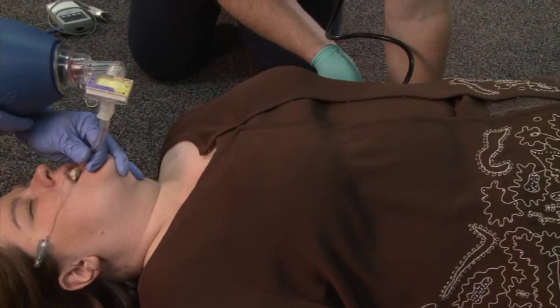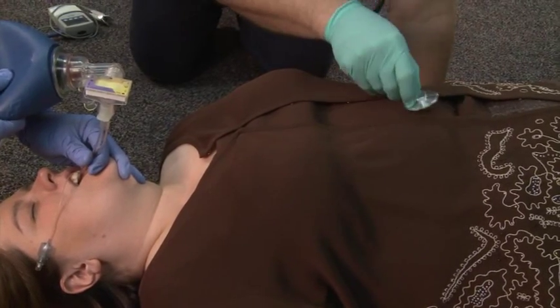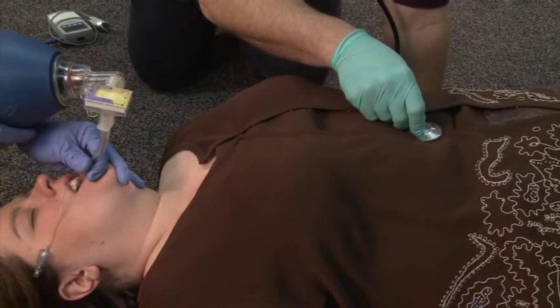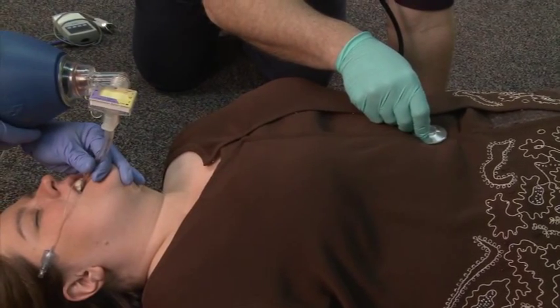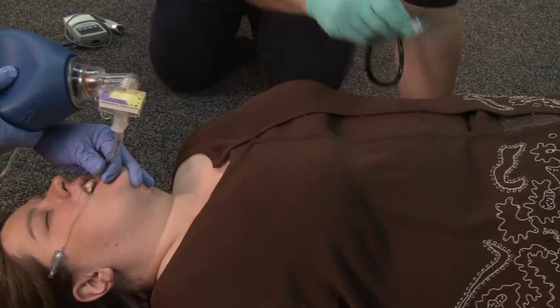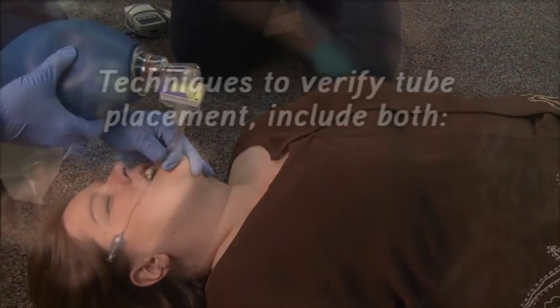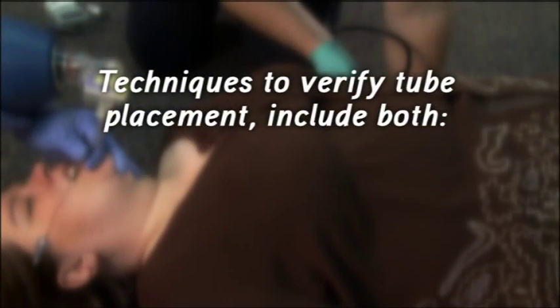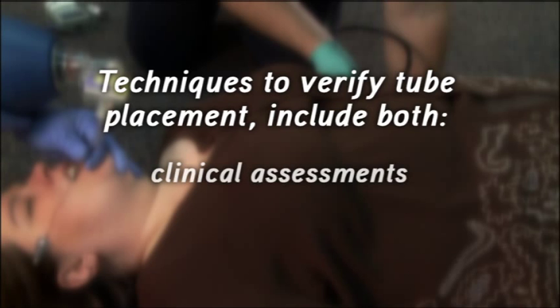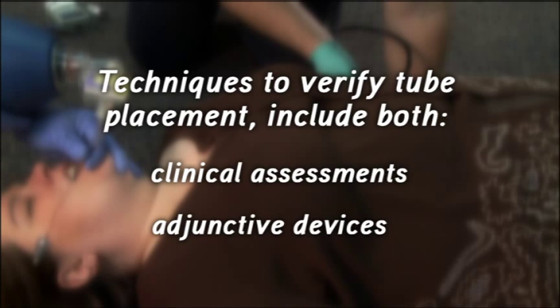Once intubation has been completed, specific measures should be taken to ensure that the ET tube has been properly placed in the trachea. Techniques to verify tube placement include the use of both clinical assessments and adjunctive devices.